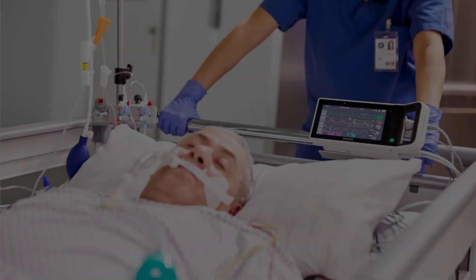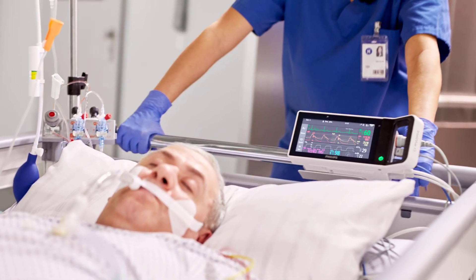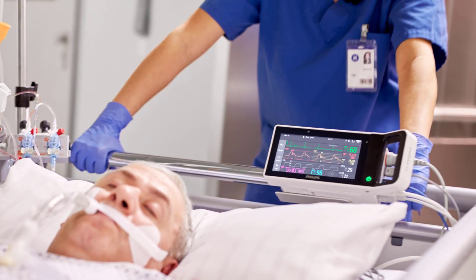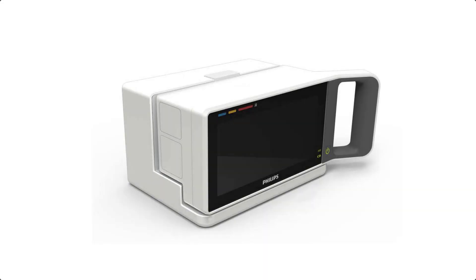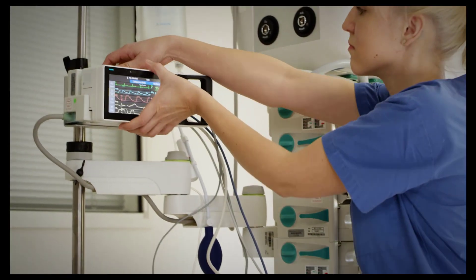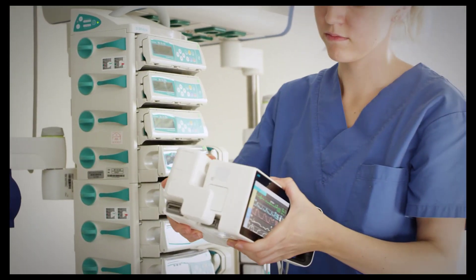You can also use the X3 as a standalone monitor or as a portable monitor. In standalone mode, you can run the monitor from the rechargeable battery, or you can use a docking solution like the Intelliview dock or the external power supply. The measurement capabilities of the X3 can also be extended using measurement extensions.